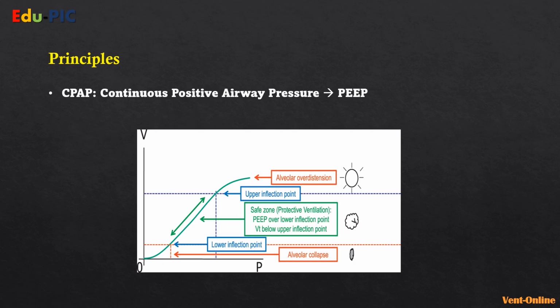So, what is CPAP as our first non-invasive module? CPAP is continuous positive airway pressure, and that basically equates to PEEP, which is the positive end expiratory pressure that you expect to keep the lungs open. So if your natural PEEP is not enough and your lung is going down, collapsing and not being really well recruited, then maybe if you push the PEEP from here to there, then that is getting you in a better point to open up the lungs.